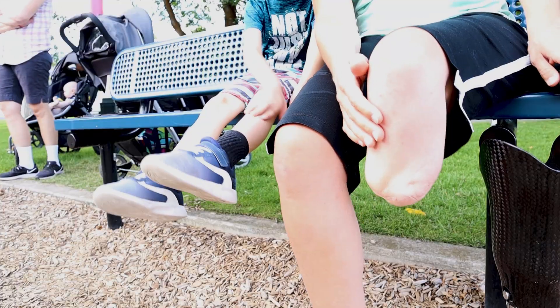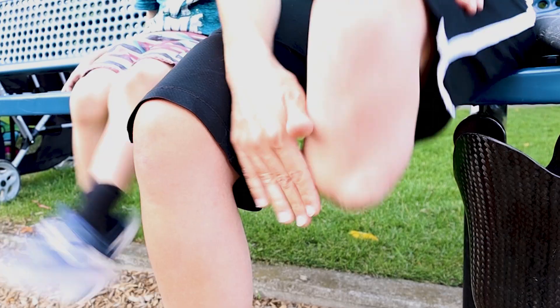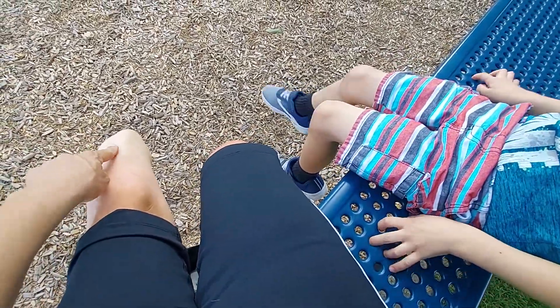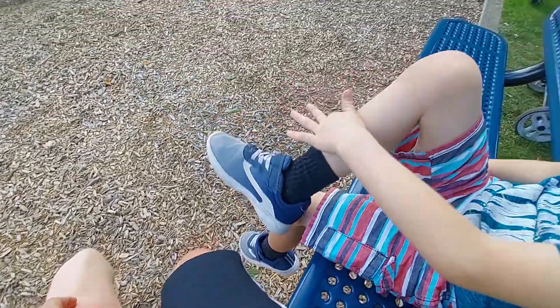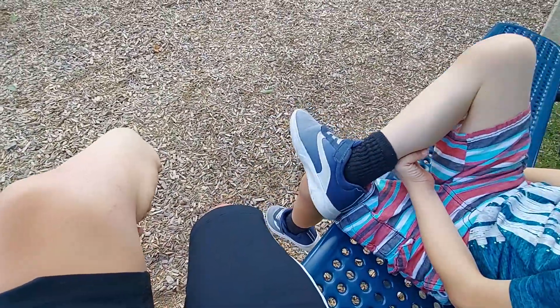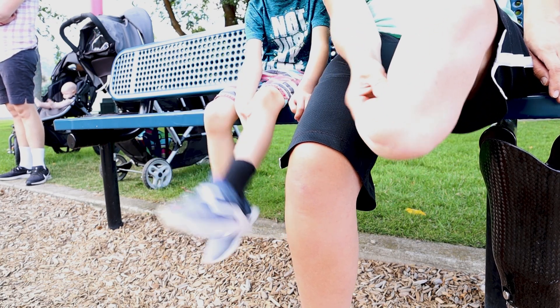I'll point out that my leg is just like his leg up to this point — I'm just missing everything under that line. I've got the same bones in the same places, they're just shorter. And if you feel the back of your leg, that's what my calf feels like too, though maybe mine's a little squishier. That muscle doesn't get much exercise without toes to wiggle, so it's a little out of shape.